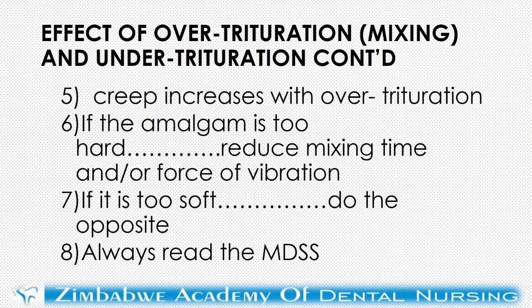about trituration of amalgam. But always read what we call the material data safety sheet, MDSS, because different products have slightly different specifications to do with how much time you need to program the amalgamator machine, how much force you need to program the vibration force, and so on and so on. Even the expiry dates and so on. So always read the material data safety sheet, which is enclosed in the packet or the package of the amalgam. And don't throw it away until you finish using the product.